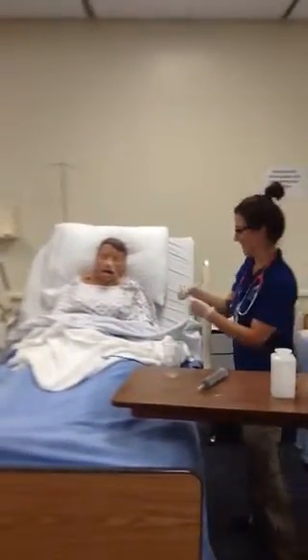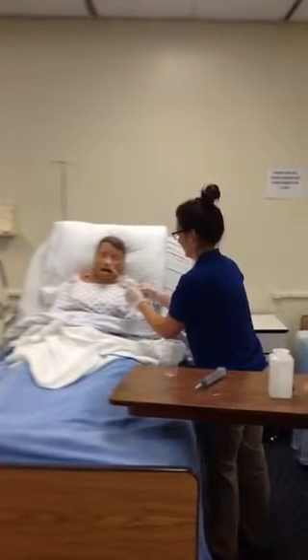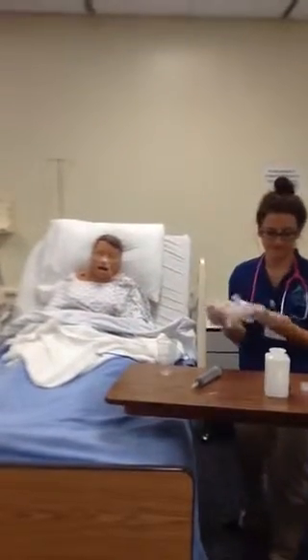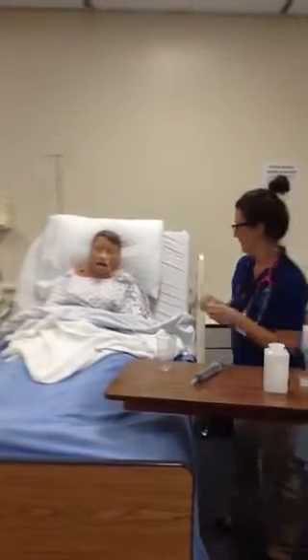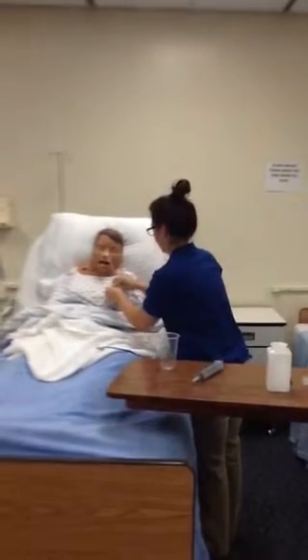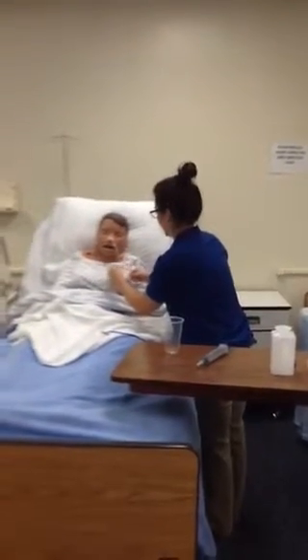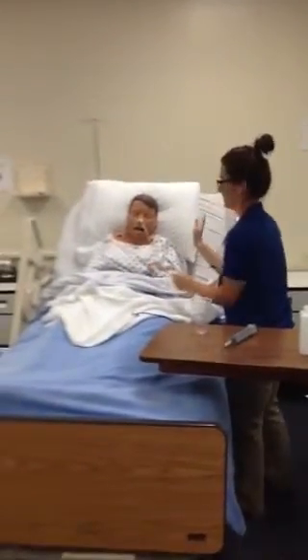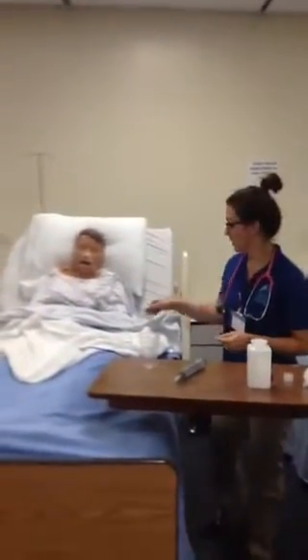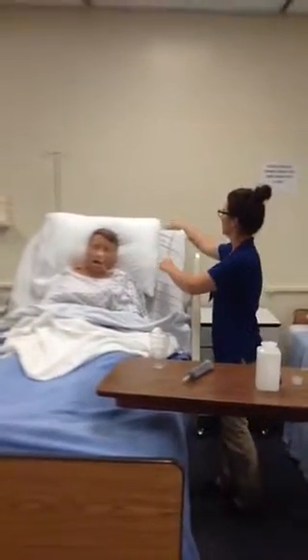Alright, so now I'm going to place the rubber band. And this just allows Mr. Wilson to be able to move his head without pulling the NG tube out. Now I'm going to attach the nasogastric tube to the suction source.